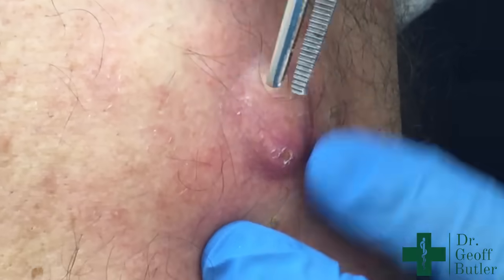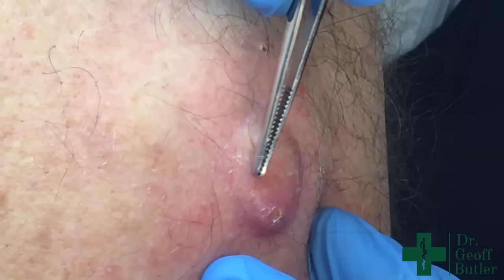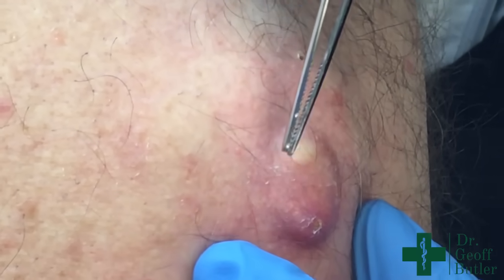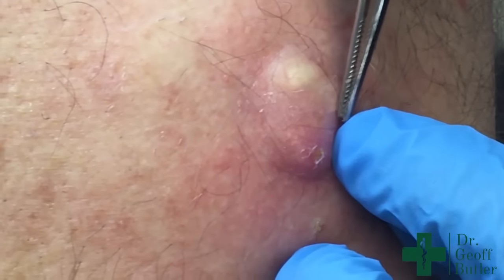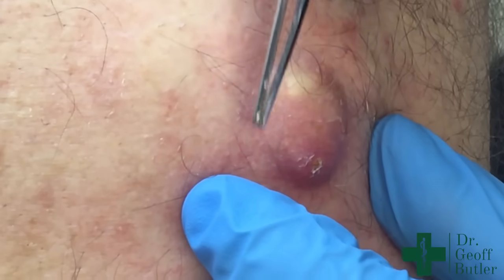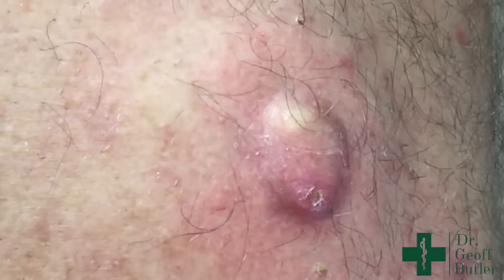When it's raised like this, the membrane is going to be very, very superficial. What I'll try to do is just make a fine linear incision and see how we can explore that. I would tell whoever's doing this procedure that you could easily convert it — if I feel like it's ruptured and we want more space, I could convert that to an elliptical incision. The reason I'd start with a linear incision is that sometimes it's simpler afterwards — you don't have to add the deep dermal sutures. We'll see how this goes and proceed from there.